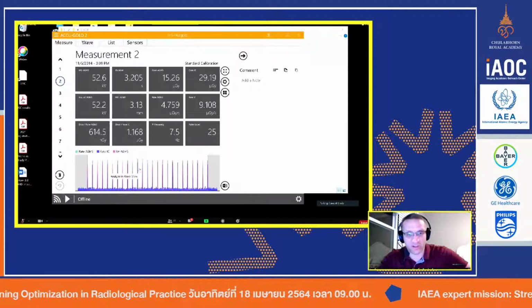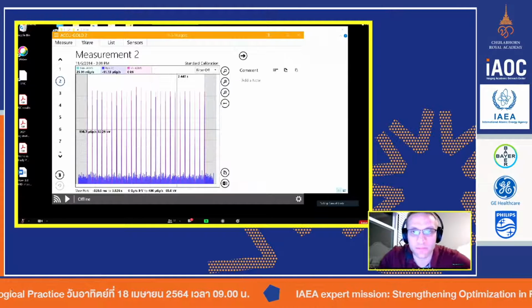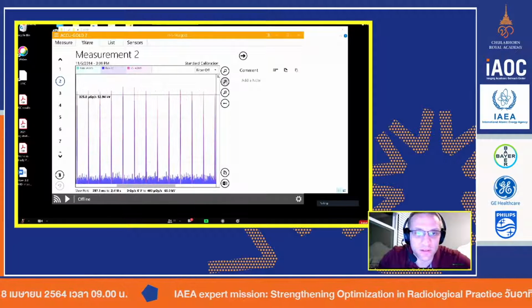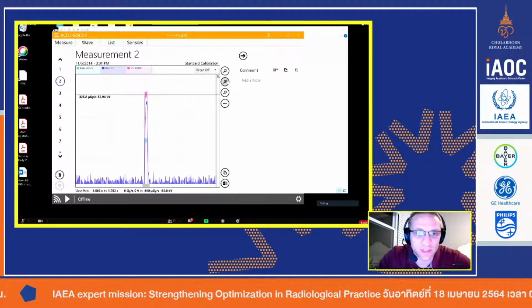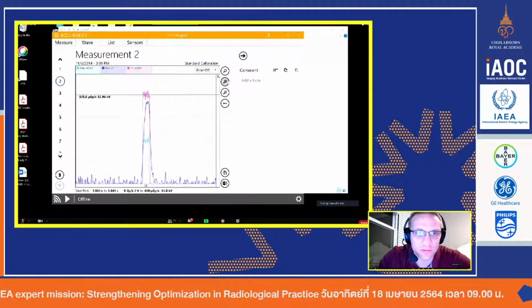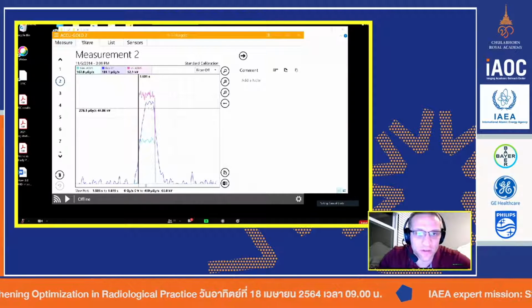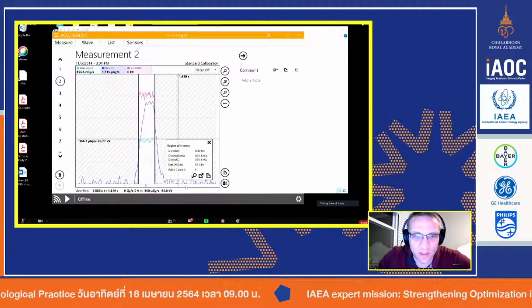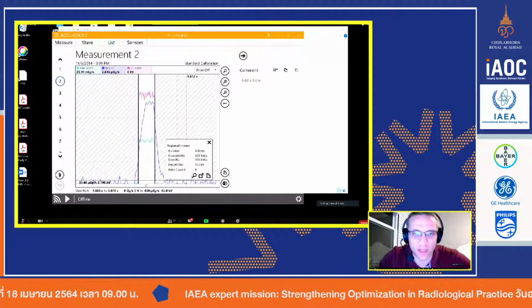If I actually click on this button, actually let me, I'll be darned. And if I zoom in really far, now you can see the pulse width. And I can come over here and I can measure my pulse width. And my pulse width was 3.8 milliseconds right there.